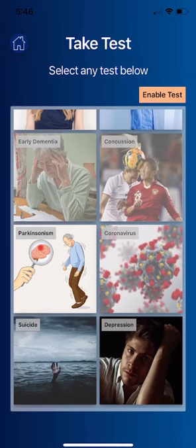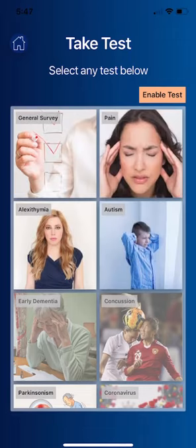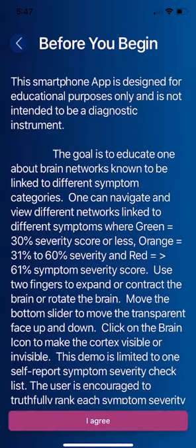We also have a suicide and depression questionnaire, which is especially important today as we go through the issues of the coronavirus and the stresses we're all experiencing.